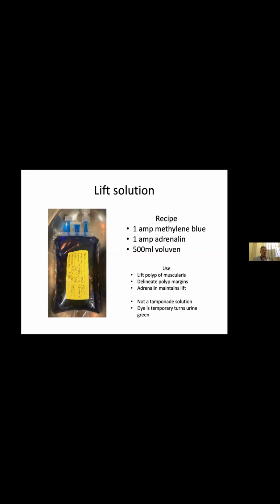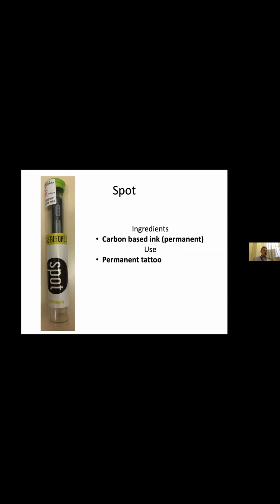Don't confuse this with spot, which is essentially Indian ink. It's a carbon-based tattoo, and it is permanent. It is used to tattoo where a cancer is if you're going to do laparoscopic surgery, or tattoo where a polyp is if you want to come back and see where it is.